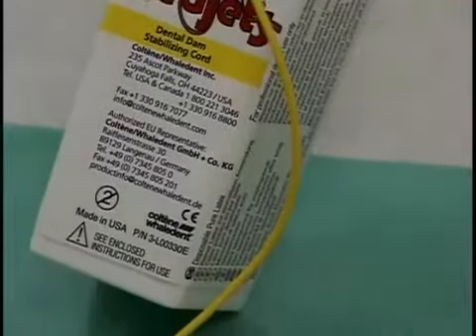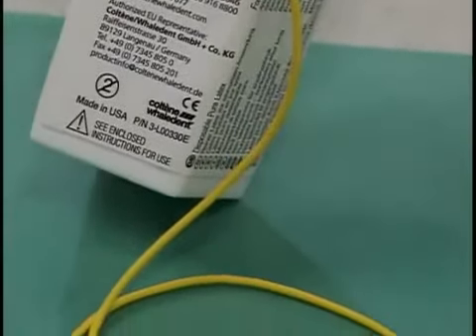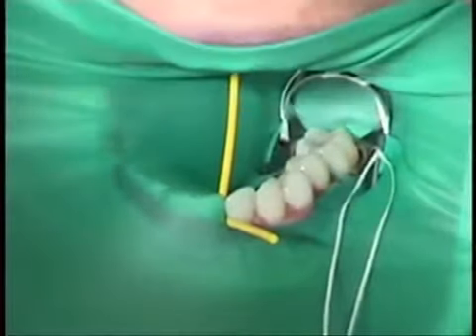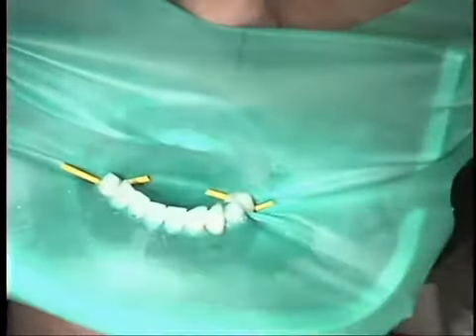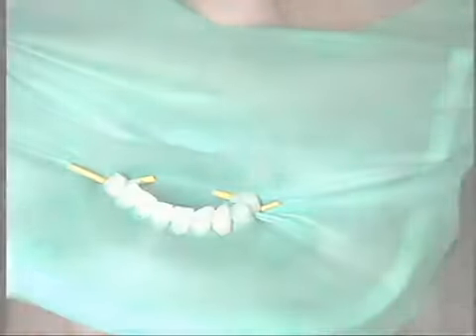Wedgetts Dental Dam Stabilizing Cord is simply stretched between the contacts at the distal end of the isolation. Wedgetts Cord may be used in either the anterior or posterior region as long as there is a distal contact present.